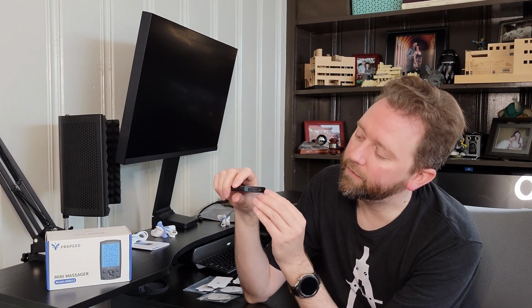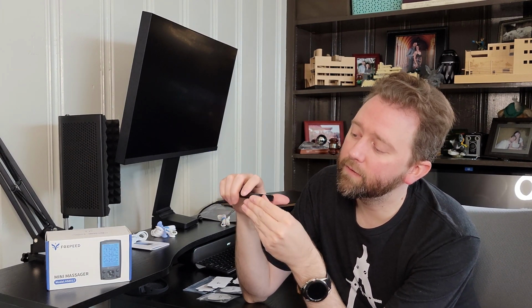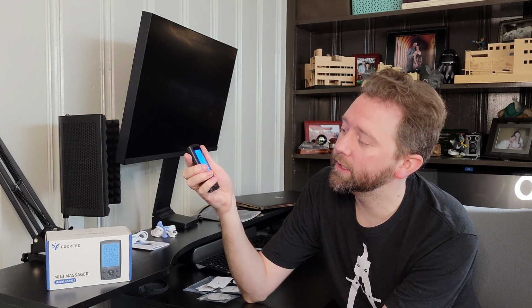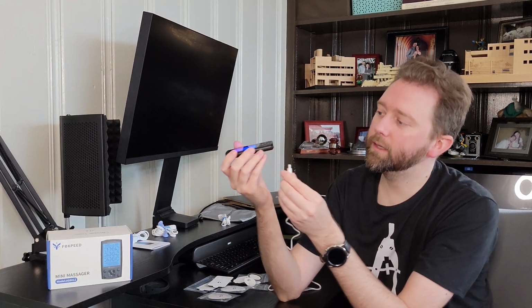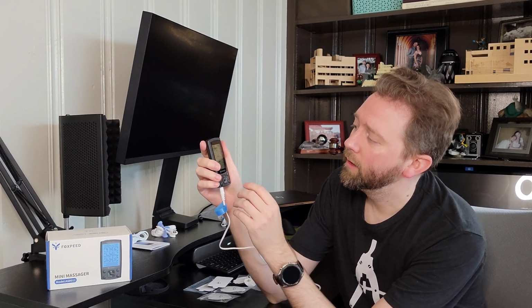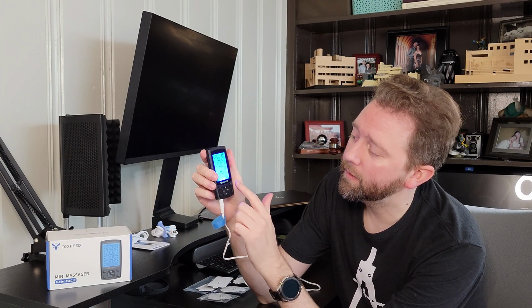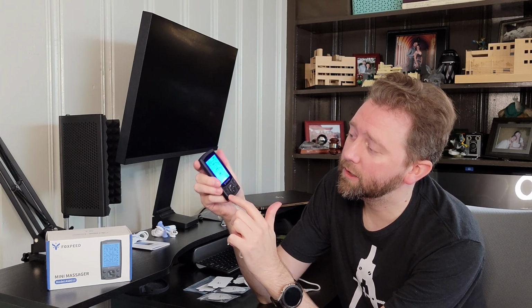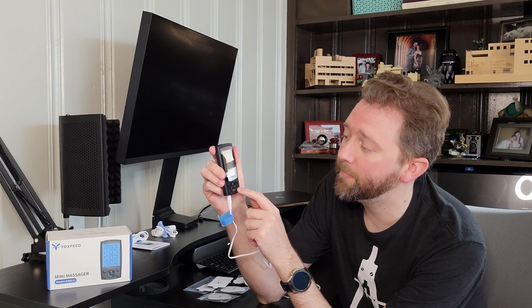On the top here is a little flap. That's where you charge it. And then you have a toggle here, which turns it on. Like I said, on the bottom here is where you plug it in. So we'll plug this one in here in mode A. Pretty straightforward. Now you're going to have the plus and minus on either side. So this side is going to increase the intensity on channel A. This is going to increase the intensity on channel B.